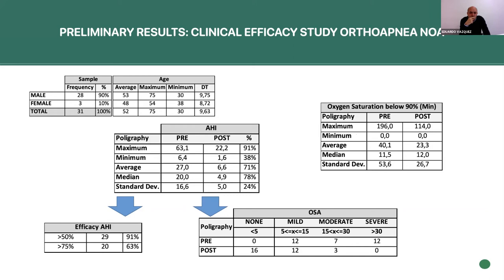We haven't thought of that. So you mean that the patient only contacts in the front teeth and there's no contact in the back teeth? That's what you're saying? Yes. That's the question, yes. Well, we have not designed the device in that sense.